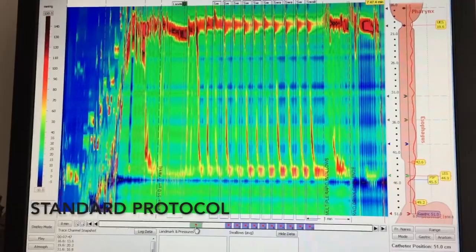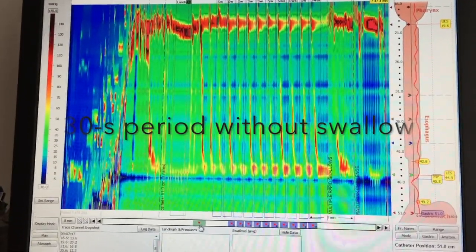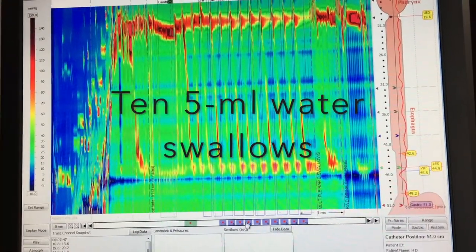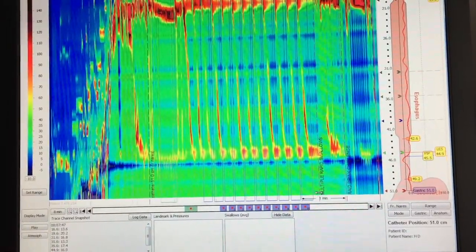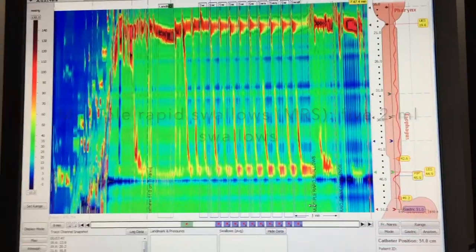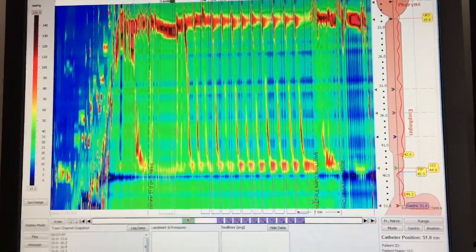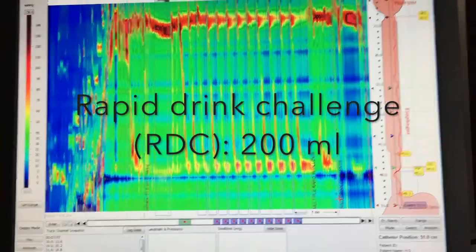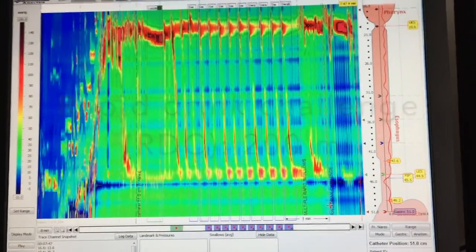Our regular protocol consists of a period without swallowing — a 30-second period — then we perform ten swallows of 5 mL water in a supine position. We are also doing a multiple rapid swallow test, which consists of 5 swallows of 2 mL water less than 4 seconds apart. And finally we are performing a rapid drink challenge, which consists of drinking 200 mL water as fast as possible.